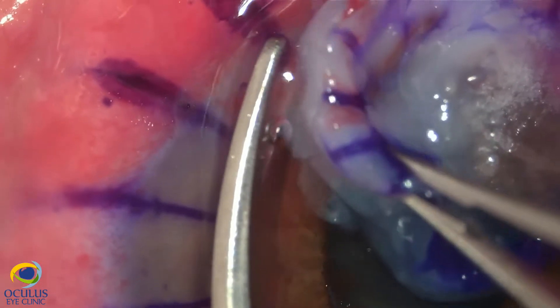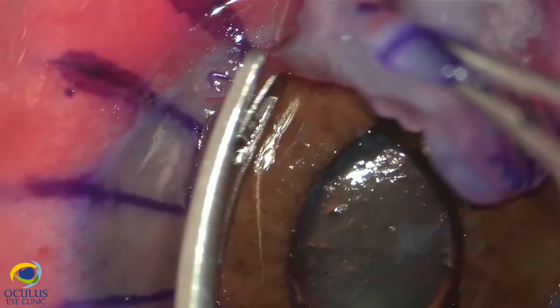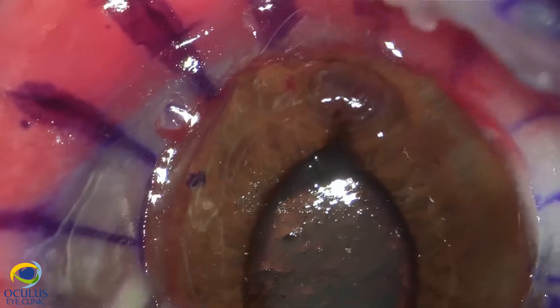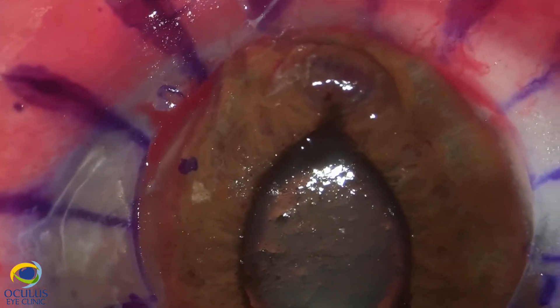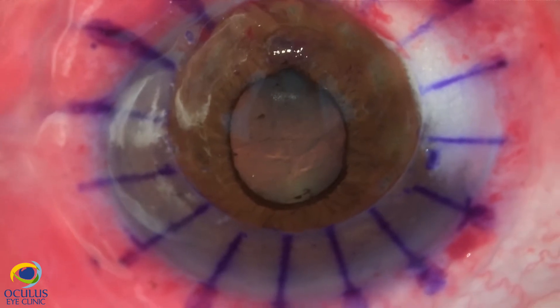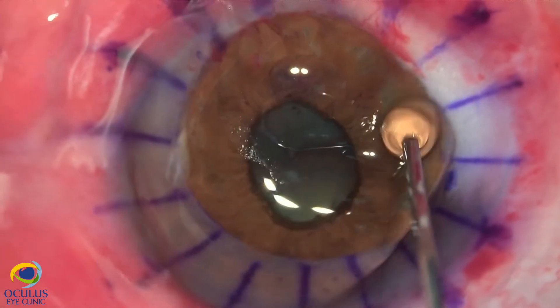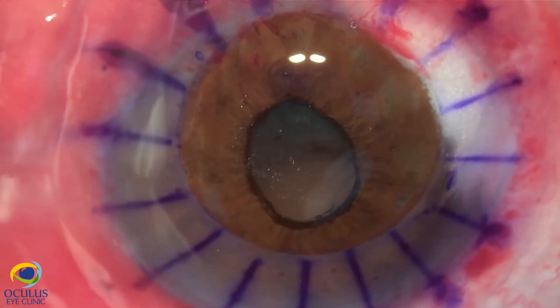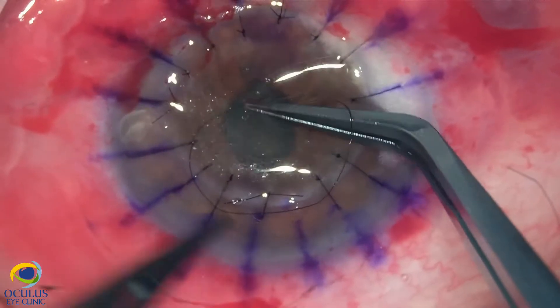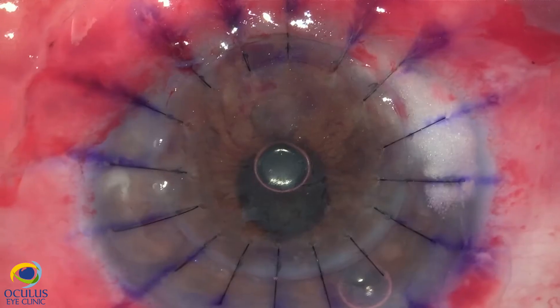We also need to avoid lens damage because the lens appears quite transparent at this stage, and we do not plan to perform cataract surgery at this point. We protect the lens and iris with methylcellulose and OVD, and now we follow the standard suture of the graft.